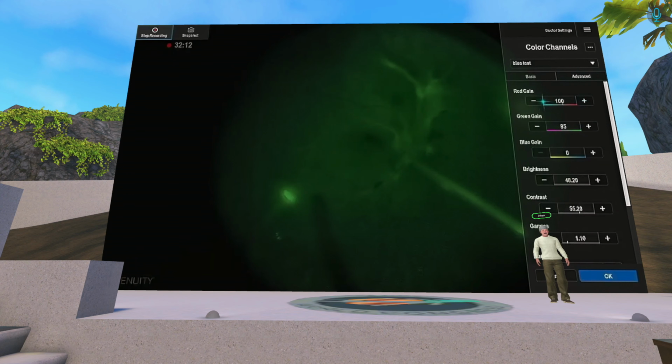When I want to get really detailed on the tissue, I put the straight light to that area of tissue, and otherwise I have the chandelier, which, as Lukan mentioned, is certainly adequate. With the Constellation light source, you can see pretty well throughout most of the retina with the chandelier.